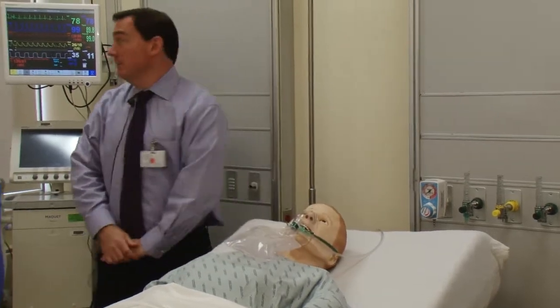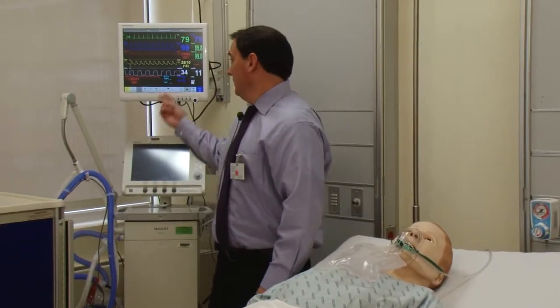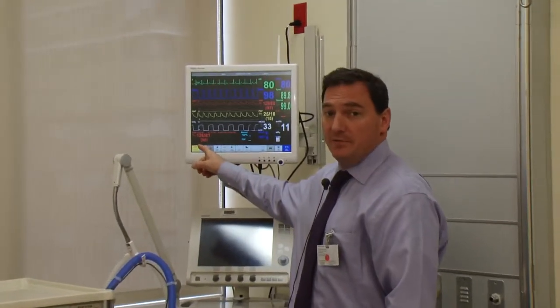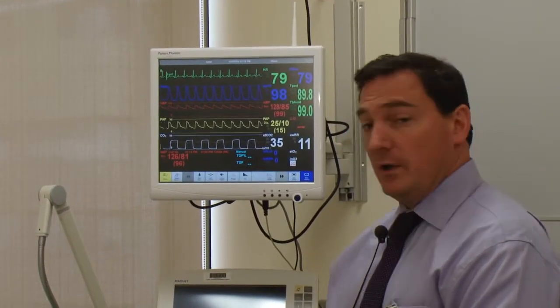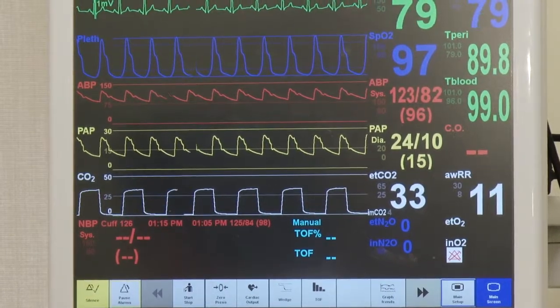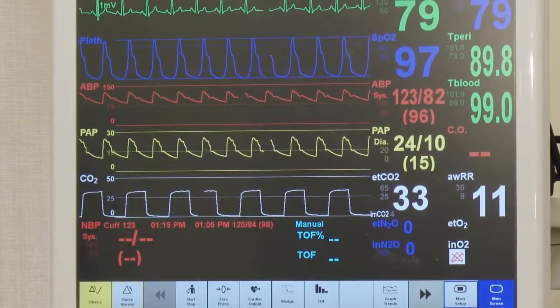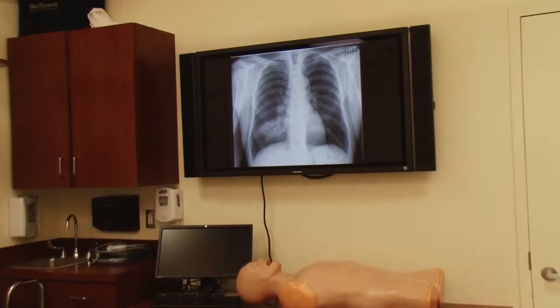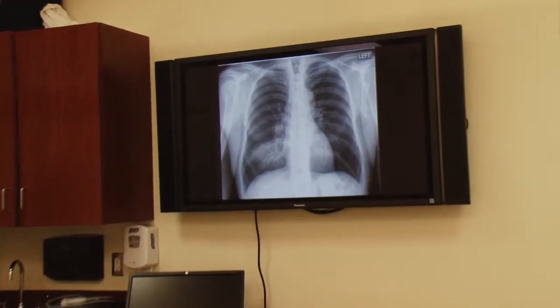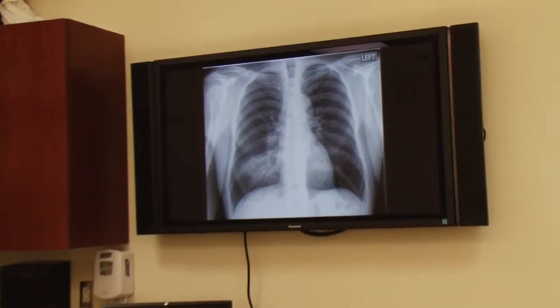If vitals are needed, or an EKG is needed, these will appear up on your monitor. It's important to note that the blood pressure on the bottom left-hand corner of the screen will not continue to recycle on its own. If you would like to repeat blood pressure, you must push the start-stop button to get your blood pressure reading. If you request labs or imaging, they will be provided to you on the television located within the simulation lab. Requesting consult services may be a part of your session, and they may respond in person or as telephone consults.